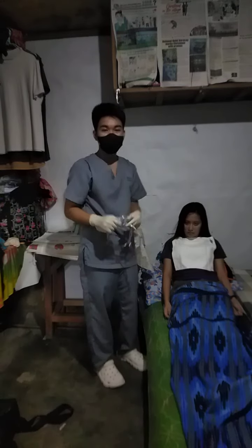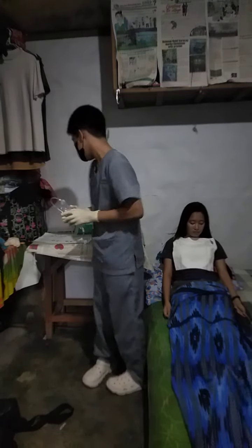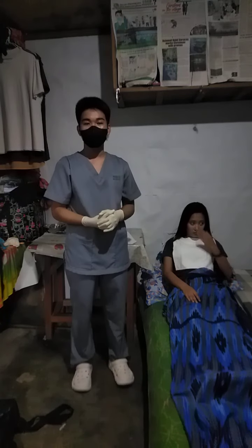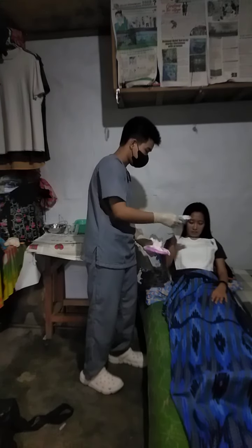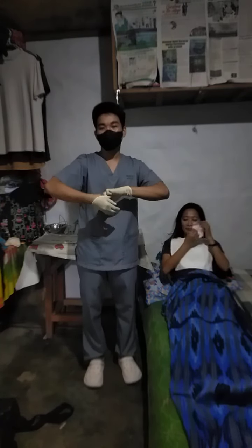Then dispose of the tube in a proper receptacle to prevent residual leaking of fluid from the tube, minimize client discomfort, and prevent transmission of microorganisms. Then offer tissues to the client to blow the nose, provide oral hygiene, and clean the nasal passages of remaining secretions, which promotes client comfort. Tissue po. Then remove gloves and perform hand hygiene, for it reduces transmission of microorganisms.